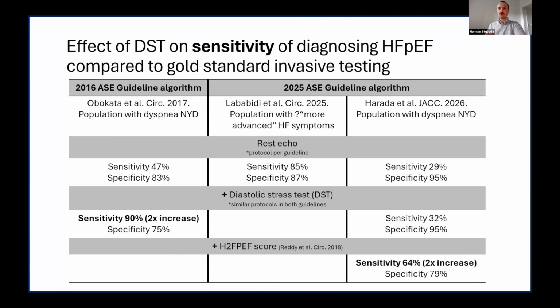So overall, having a little bit of this contradictory evidence for the value of diastolic stress testing, I just wanted to highlight that this area is actively being investigated and the evidence base is evolving. And so at the end of the day, we as cardiologists have to be mindful that this test can be helpful in patients with high pretest probability, but it also has pretty major imperfections and challenges as well.